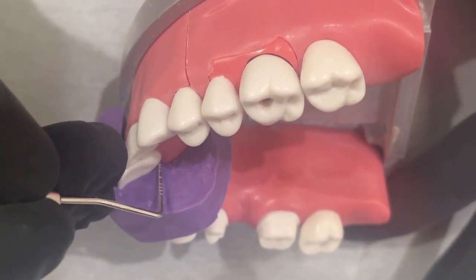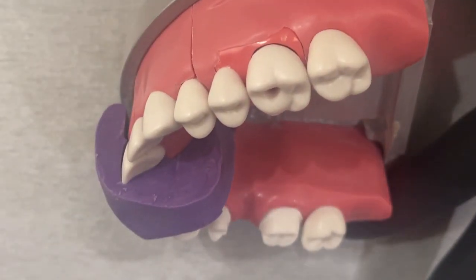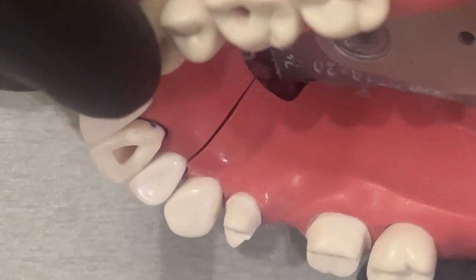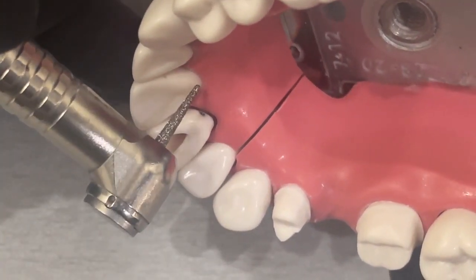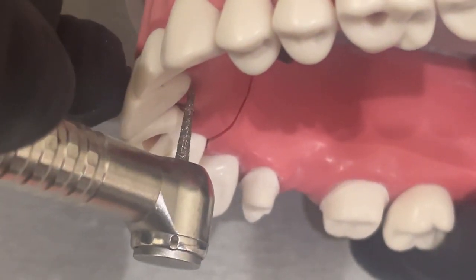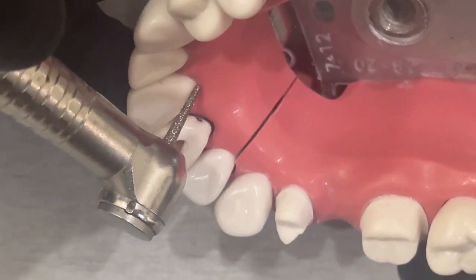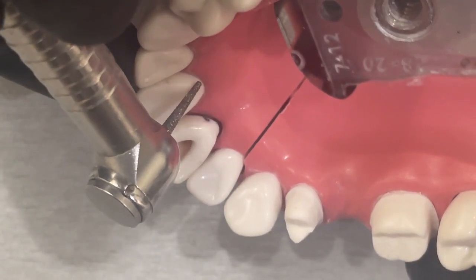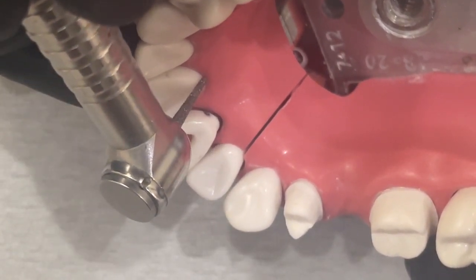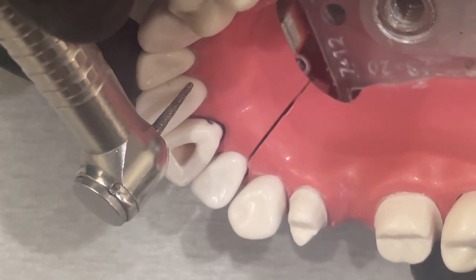As we're prepping, I'm going to keep my bur really straight up and down. I'm going to start with my three depth cuts, remembering to keep the bur at a very straight angle. I'm going to make three depth cuts staying 0.5 millimeters above the gingival, or even a little bit more than that.